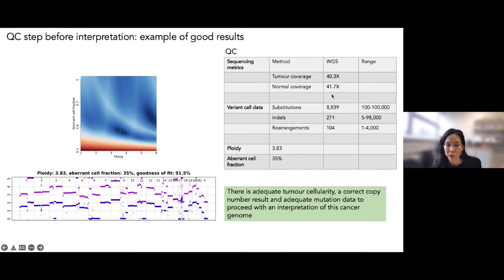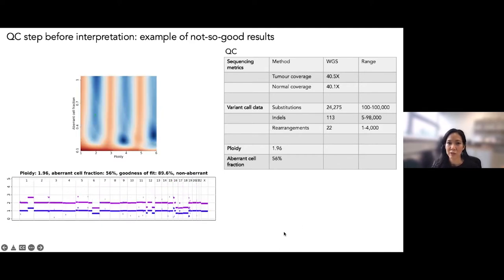Here's another one — tumor and normal coverage just about right, substitutions, indels and rearrangements reasonable, ploidy high, aberrant cell fraction a little bit lower. Nice clear plot — adequate tumor cellularity, correct copy number, adequate mutation data to proceed. Sometimes you get a result where the plot shows an alternative option that looks potentially better. In my team, we give the option of trying to re-seed — re-defining the copy number by forcing the algorithm into a different result. The real problem in this case is the tumor cellularity is only 25%, giving low tumor cellularity with an imperfect copy number result, but 24,000 mutations, 113 indels and 21 rearrangements — enough to still salvage information.